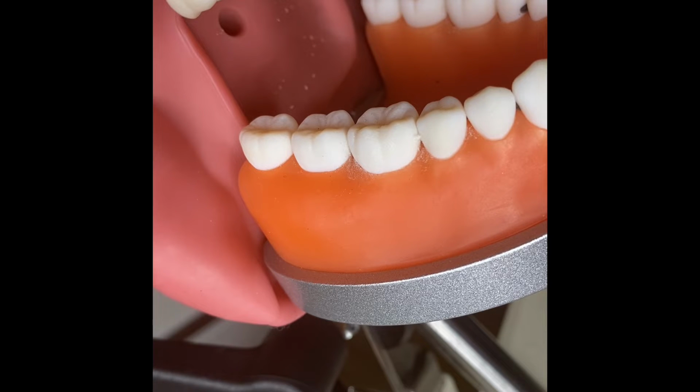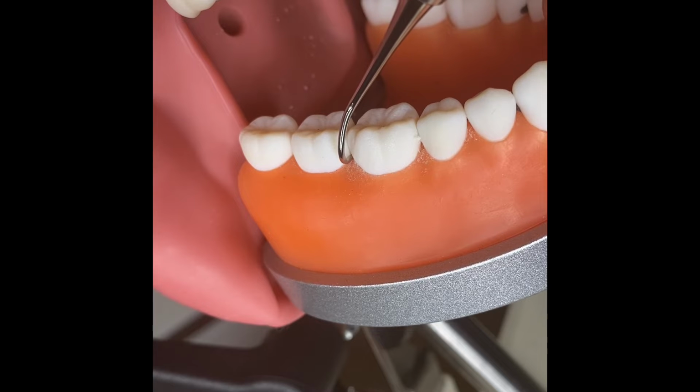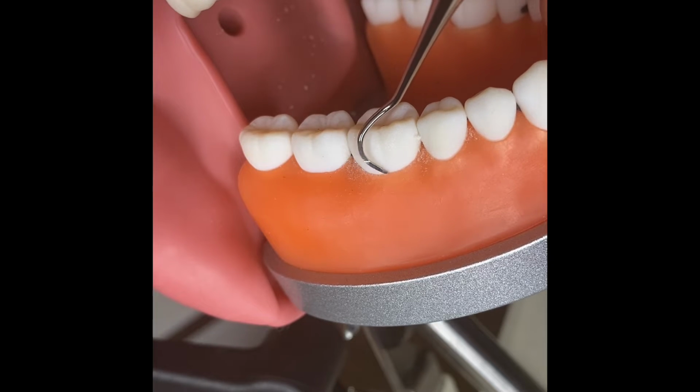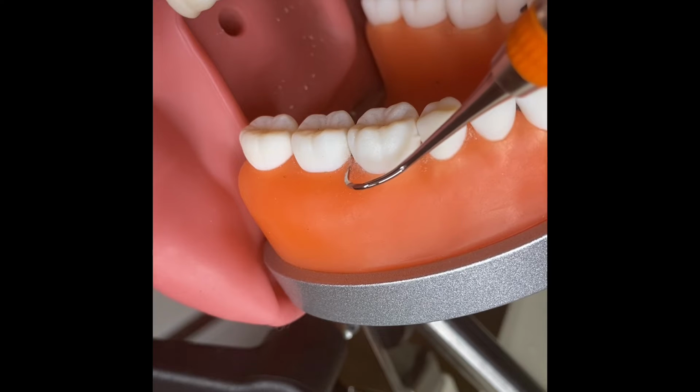First, I'm going to determine if I have the correct working end. So the functional shank is up and over the occlusal tooth, and it also hugs the mesial surface. This is what an incorrect working end would look like.